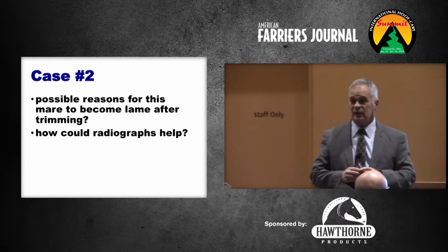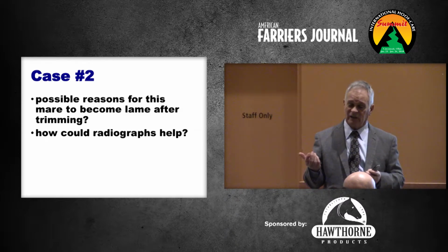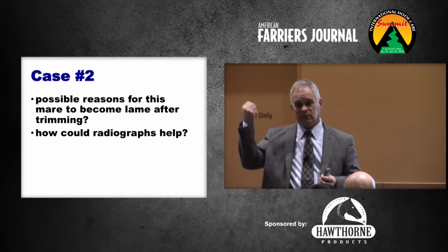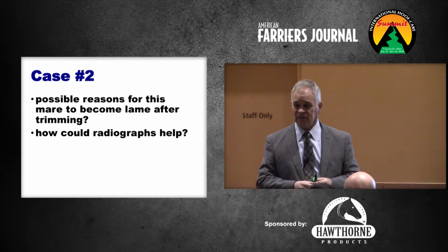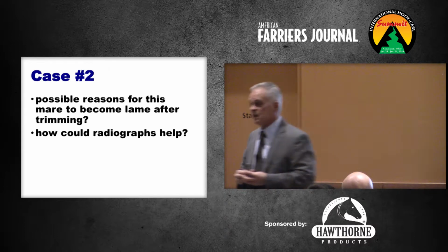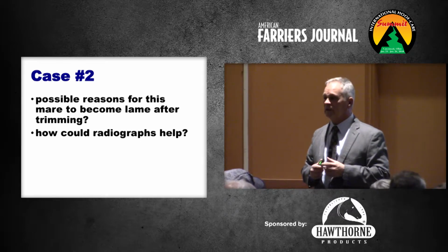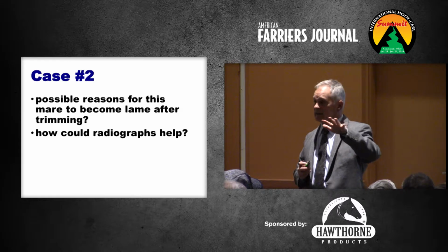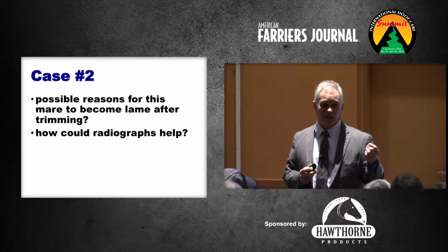Yeah, could be. So could it be trimmed too short? She's just not happy that way. If her heels get cut too much and it pulls on her deep too much, it may pull on her weakened lamellae, and that may hurt her. She was rotated 3 years ago and then got back to normal, but then hadn't been done. So, you guys are giving a lot of answers. The good news, bad news, there's a lot of reasons this mare could get sore, right?